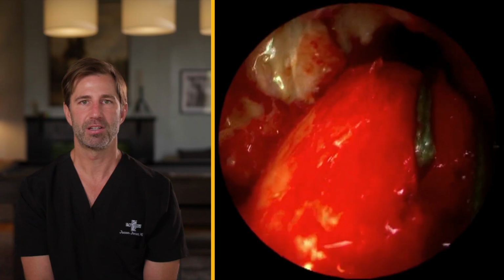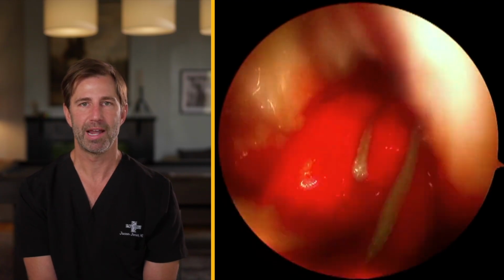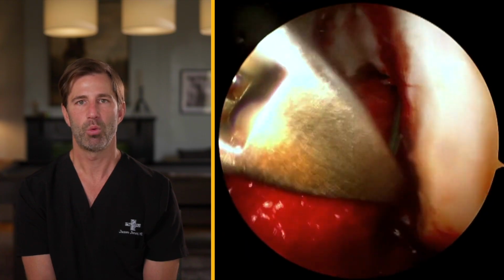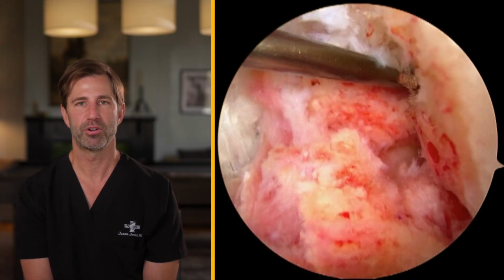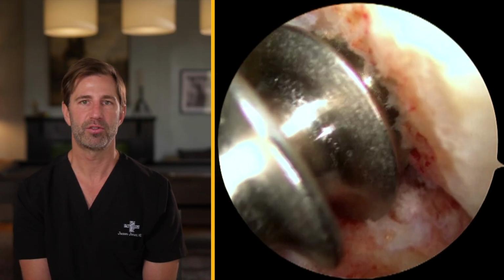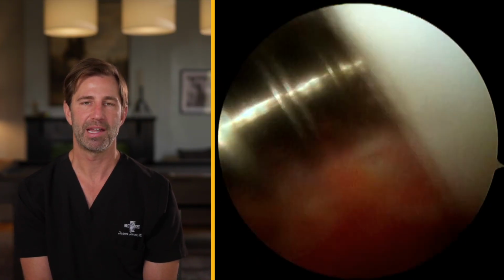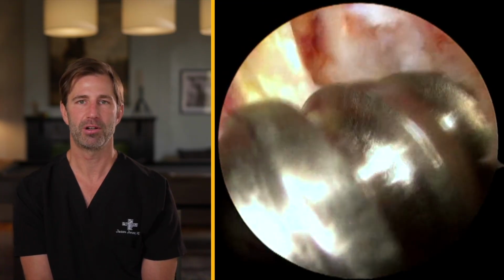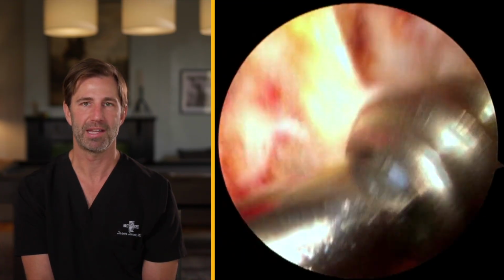Once this is lodged into the femoral bone tunnel, which we've already created, we will lock this into place with the use of metal screws. One metal screw is placed anterior in order to push the bone plug slightly posteriorly. This allows for a more normal position of the ACL. We then tension the ACL and we'll cycle this in order to create maximum tightness around the ACL.